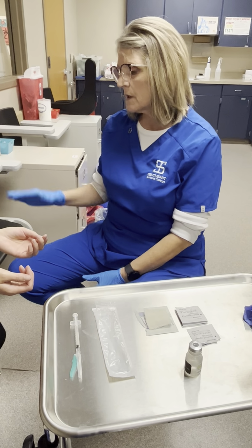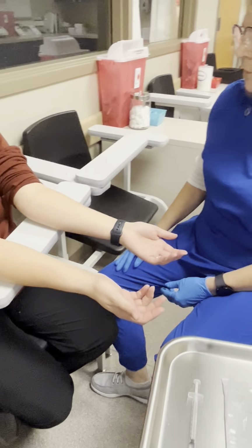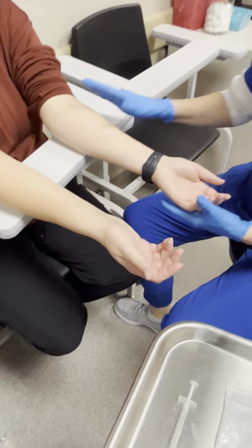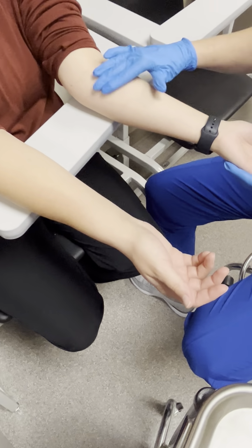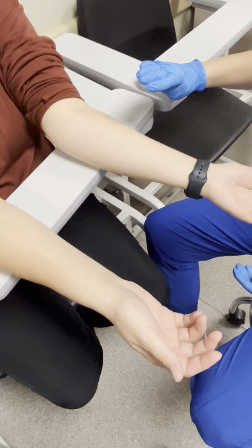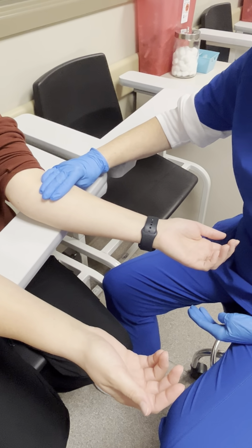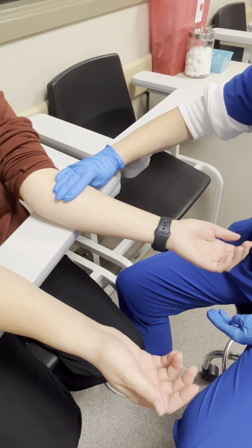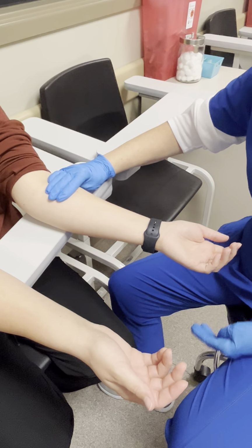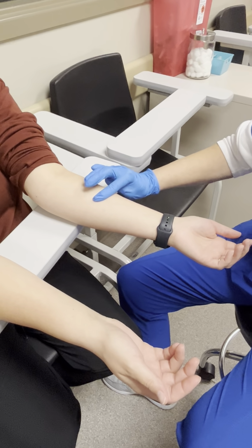In the case of this TB skin test today, we're going to choose a site. The first thing we want to do is look at the lower anterior arm. We're going to focus on this area here, but in general, you want to have maybe 4 fingers, which is like 2 to 4 inches down from the crease of the elbow here. So we're going to focus right here in this area for the injection.